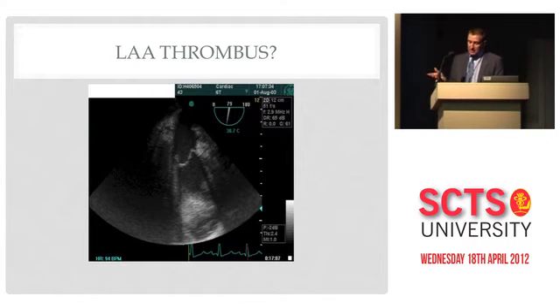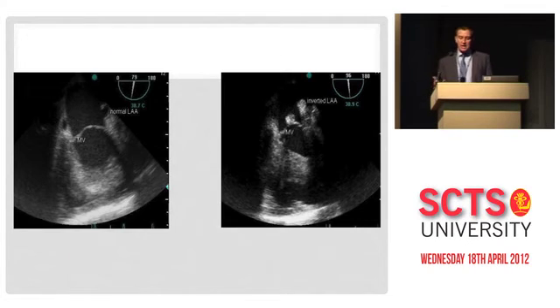So I thought a little bit about this. The surgeon had put a lot of tissue glue around the root of the aorta, and what we have here is an inverted left atrial appendage. We reported this to one of the journals. It's not very common, but the appendage is a bit like a windsock, and it can invert quite easily. The decision was clearly to leave it. We had to scratch our heads for a few minutes, but we decided to leave this alone. We gave some more filling, the left atrial pressure increased, and the left atrial appendage reverted to normal.